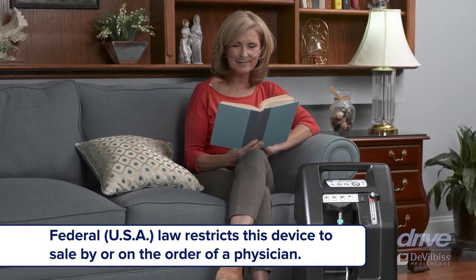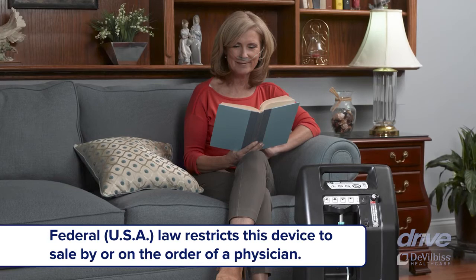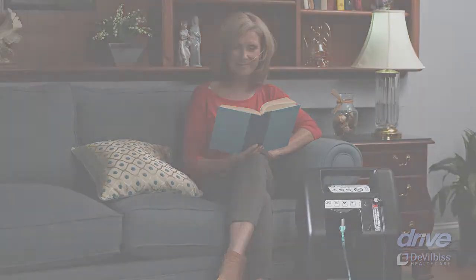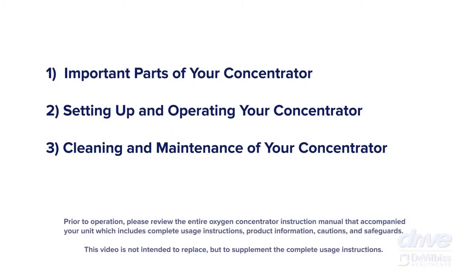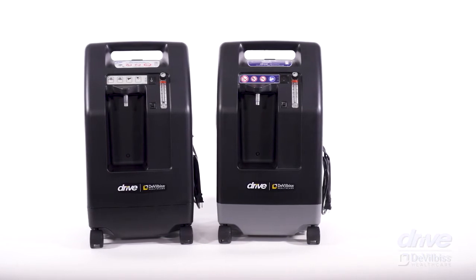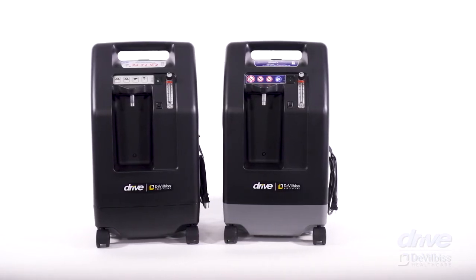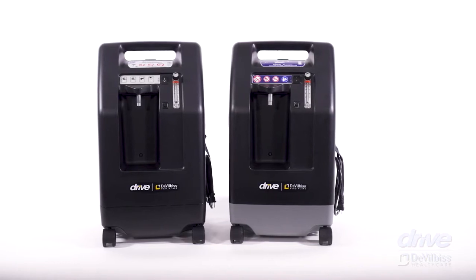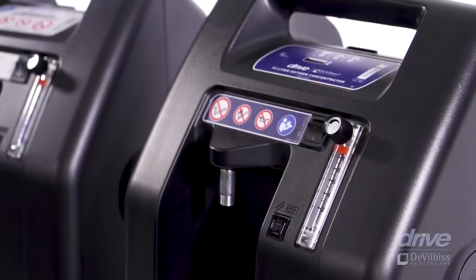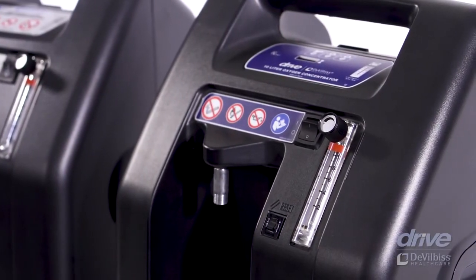Based on your liter per minute need, your equipment provider will set up the Drive DeVilbiss 5-liter or Drive DeVilbiss 10-liter oxygen concentrator. In this video, we will provide an overview of important parts of your concentrator, setting up and operating your concentrator, cleaning and maintenance of your concentrator. The Drive DeVilbiss Oxygen Concentrator is intended to provide supplemental low-flow oxygen therapy for patients suffering from COPD, cardiovascular disease, and lung disorders. It is designed for use in homes, nursing homes, patient care facilities, and other similar environments.